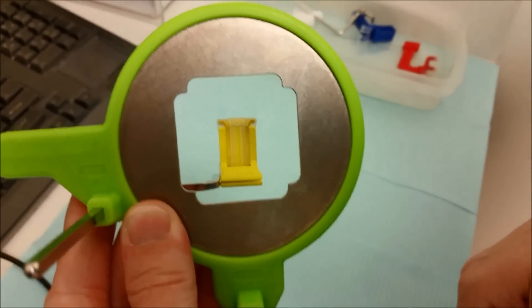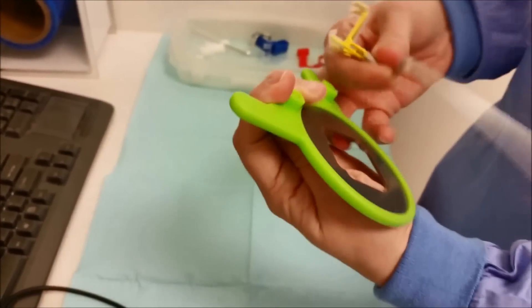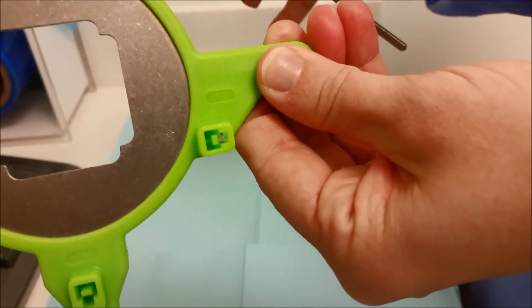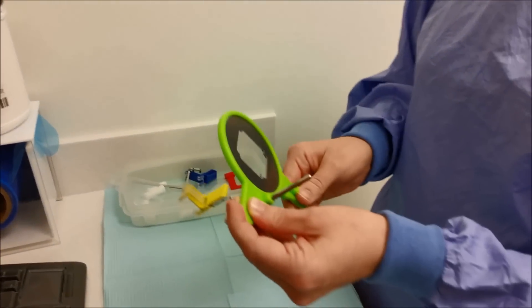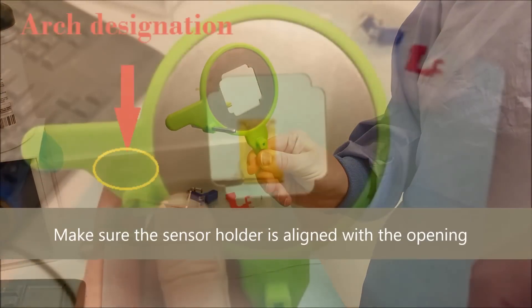Upper left, lower right. And on the other side, just to show you, it says upper right, lower left. So that's how you assemble the posterior x-ray holder.